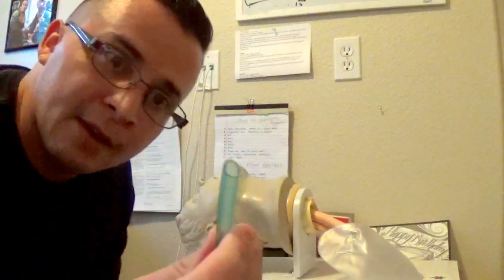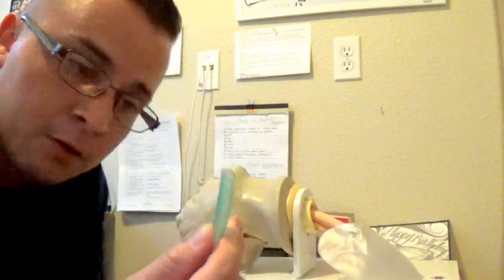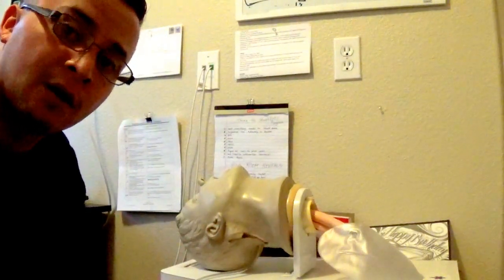Now we have the NPA. That part right there we call the bevel — the slant, the 45-degree angle. Usually we want to put this in the bigger nostril, which is typically the right one. That bevel will go against the septum — the septum is that dividing line of your nose. You glide it against the septum and it kind of guides it. Putting it on the right nostril goes with the anatomy of the airway, whereas the left side, taking the bevel into account, would go against the anatomy.